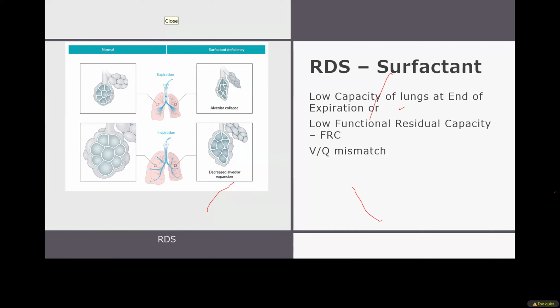And most people are now doing surfactant non-invasively by using the LISA technique, the lesser invasive surfactant administration, where you just put a catheter into the lungs, into the trachea, while the baby is spontaneously breathing. You push the surfactant into the lungs, and then take the feeding tube or whatever catheter you put out, and then the baby's put back on CPAP.